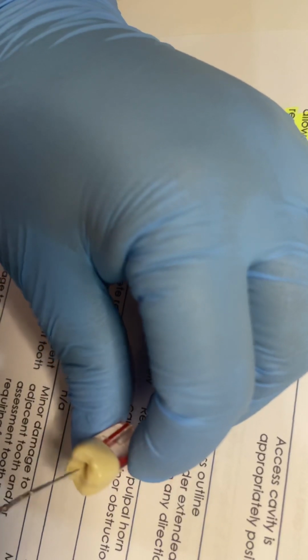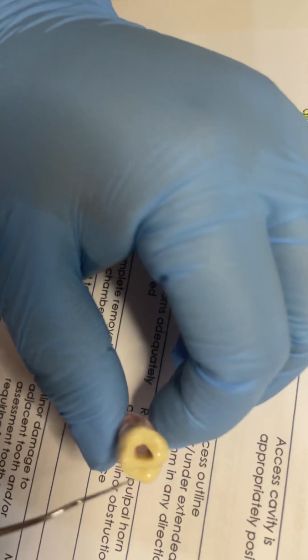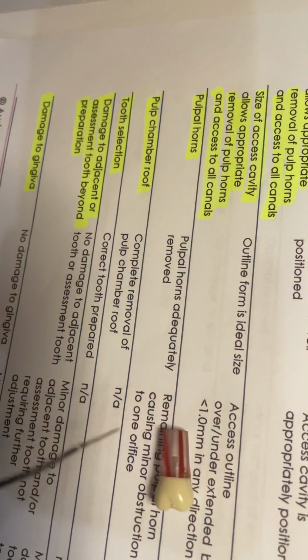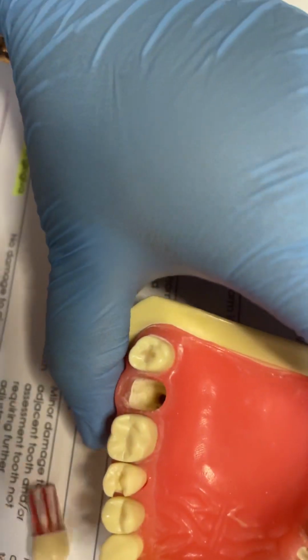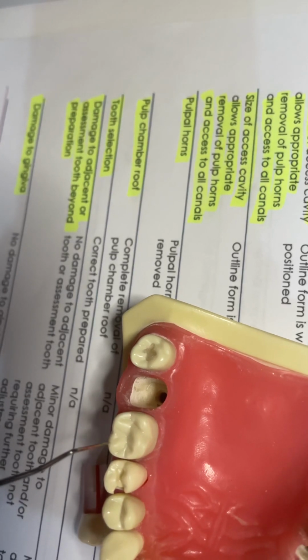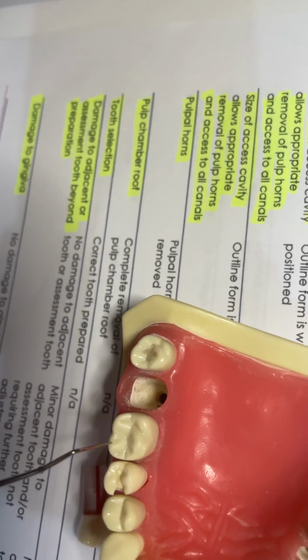If you look at the tooth, in an unprepared tooth, this is our mesiobuccal cusp. This is our palatal cusp, and this is our central pit.